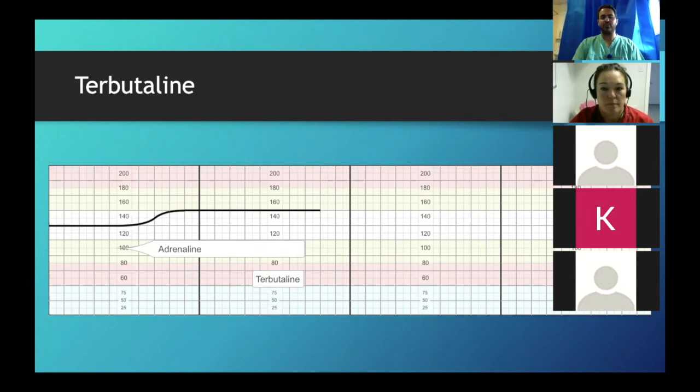But with the improvement of the baby's condition, the adrenaline should start fading away, which means that the increase from the terbutaline is going to be replaced by the drop from the adrenaline going away. It's basically going to pretty much stay the same. So the baseline is not going to go down, but it should not go up. Does that make sense? Mm-hmm. And it's only when the terbutaline is wearing off, so about 2 hours later, that the baseline should settle down.